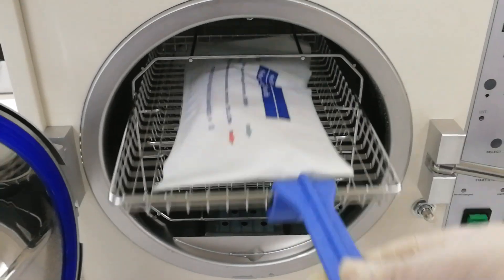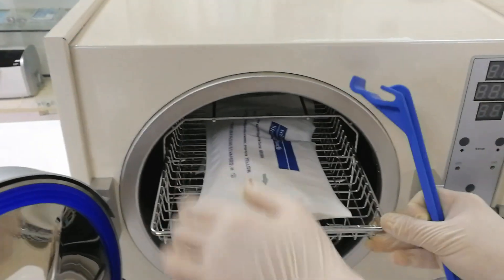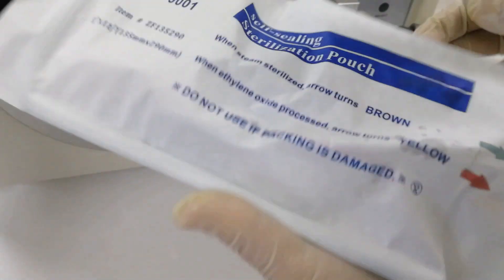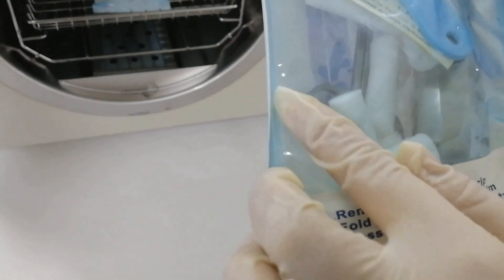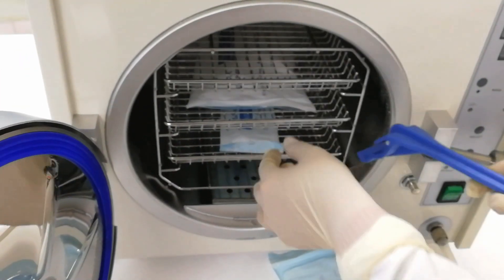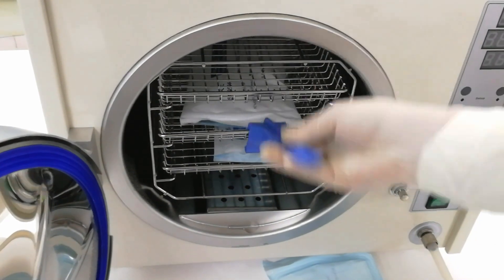We take the items out. The drying is already done. Let's look at the result.